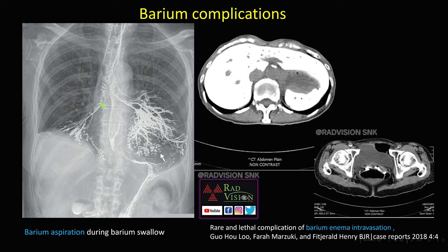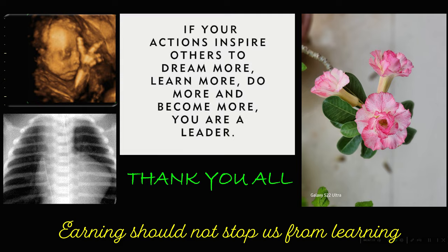Now we will see a few complications. During this barium swallow, there is aspiration of barium into the trachea and tracheobronchial tree, with opacification of the bronchial segments — this is barium aspiration. Another rare complication is barium enema intravasation, where barium is noted in the liver, spleen, and pouch of Douglas. Thank you all.